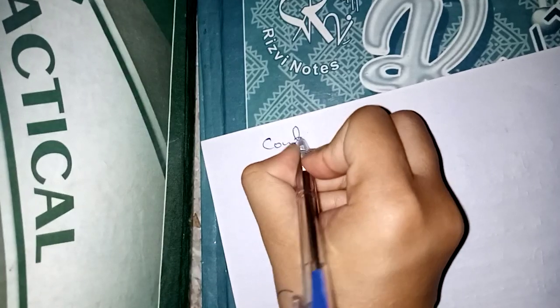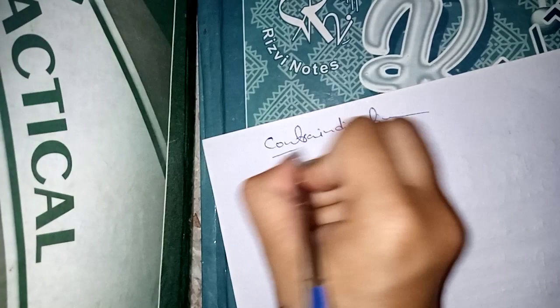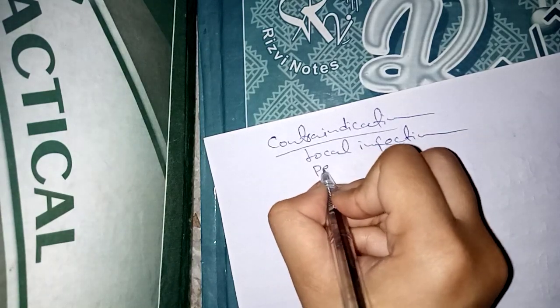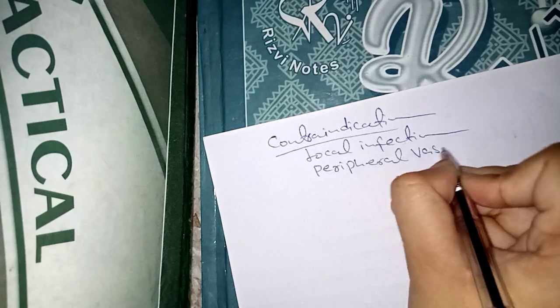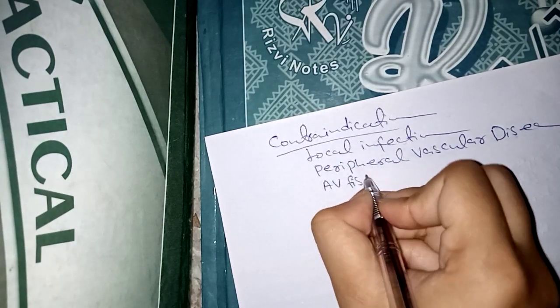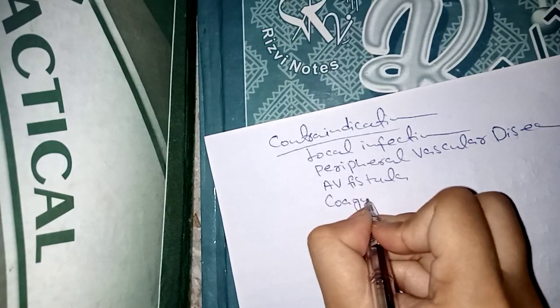And its contraindications like local infection, peripheral vascular diseases, AV fistula, or coagulopathy.